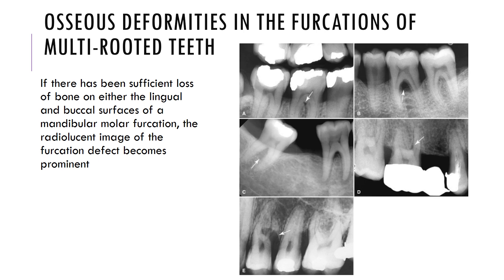Osseous deformities in the furcations of multi-rooted teeth are shown in images A to E, demonstrating different amounts of bone loss with furcation involvement. If there has been sufficient loss of bone on either the buccal or lingual surfaces of the mandibular molar furcation, the radiolucent image of the furcation defects becomes very prominent, as clearly seen in image B.